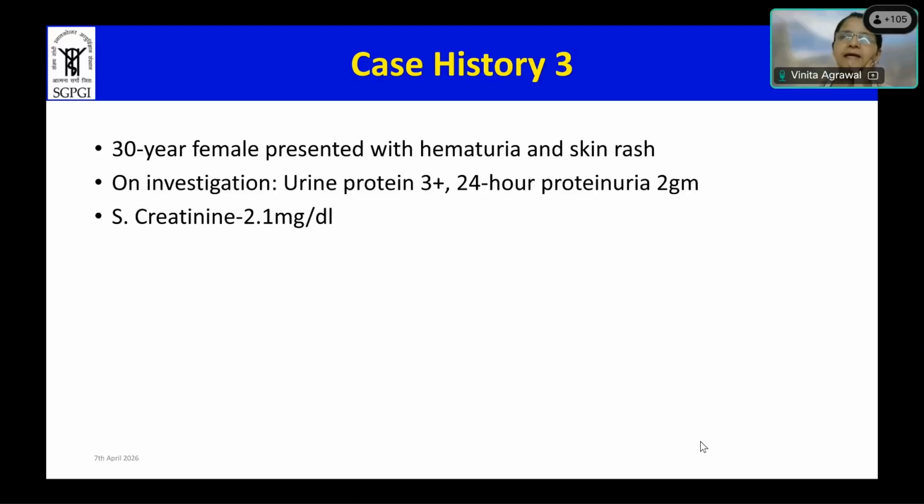Yes, yes, I completely agree, Dr. Sandeep. I did not talk of IgG 1, 2, 3, and 4, all of these subclasses of IgG, because these are postgraduates in pathology. They may get confused. But yes, you are absolutely right. Now we have started staining for all of these subclasses of IgG. So we need to do IgG 1, 2, 3, and 4, and the differential staining in all of these subclasses definitely helps you to make a diagnosis. And as you said, apart from the classical case of membranous that I have shown you, when you have FSGS and other lesions, or some mesangial cellularity, always think of other conditions, and accordingly the nephrologist will be able to treat the patient.